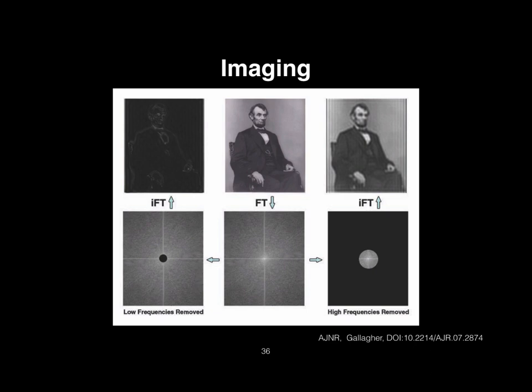So a dense K-space, where your points are close together, means you have a big field of view, and if you want resolution, then you need to go far out. But in order to travel this way, your gradients need to be on at higher amplitudes and for longer times, which requires more energy. Okay.